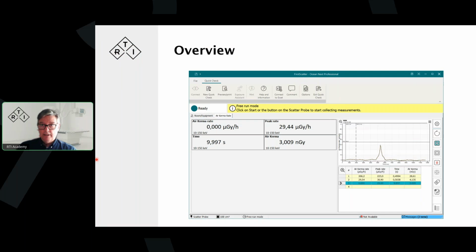The thing is, the scatter probe is so sensitive that it will pick up the differences in background radiation. So if the background radiation drops a little bit, well, then the reference is gone. So then it will register negative value in changes. And so we modified that a little bit. So we have a better filtration of it.